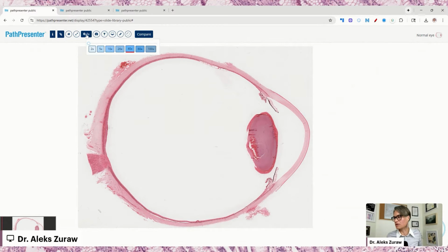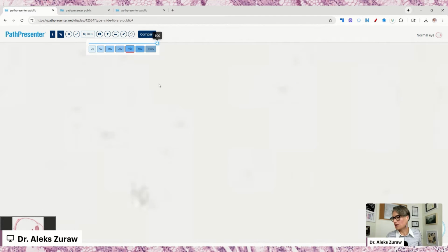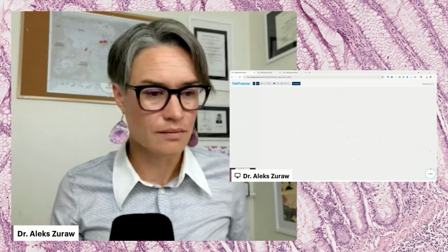It's telling us it's 0. I don't think this is accurate. Maybe it is accurate. 0 magnification, that's true. Come on, what's going on? What did we do? Oh, do you see this little thumbnail? Actually, you cannot see it, but I'll show you in a different way. No.